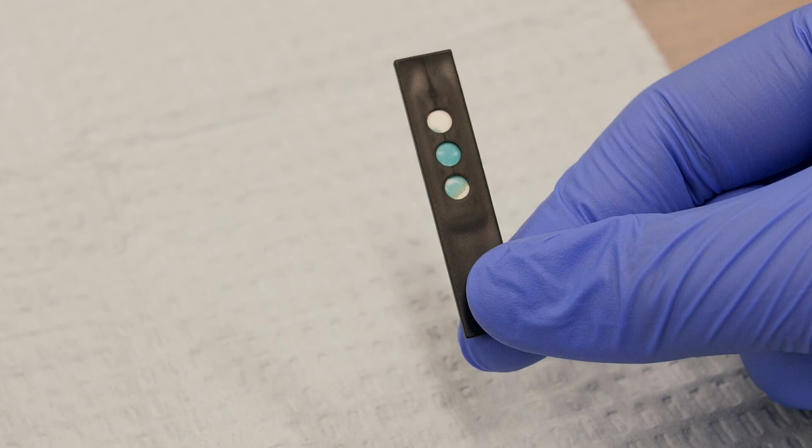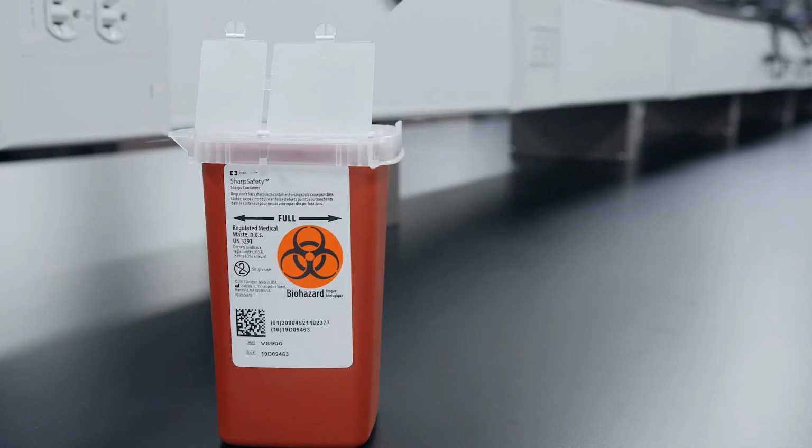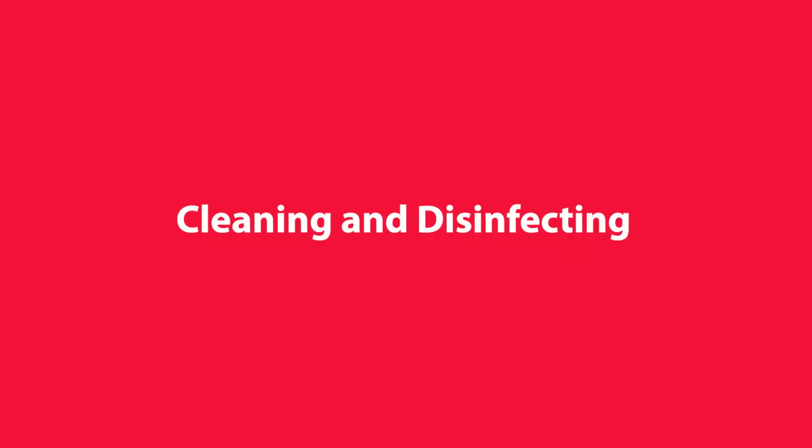Once the test is complete, record the results and dispose of the test strip in a biohazard container. To help protect your patients and yourself against blood-borne pathogens, you must fully clean and disinfect your CardioCheck Plus analyzer between each patient test and before storing.